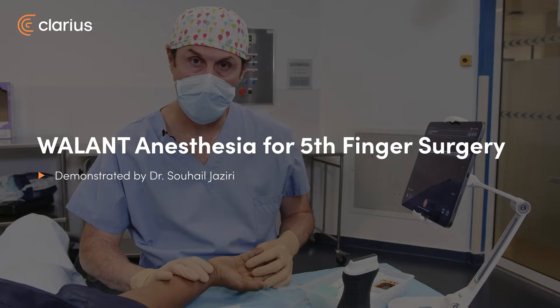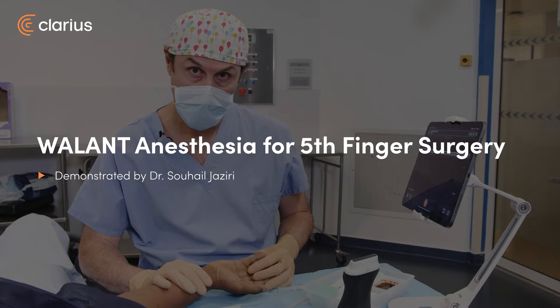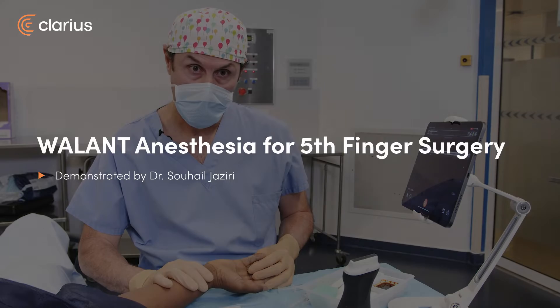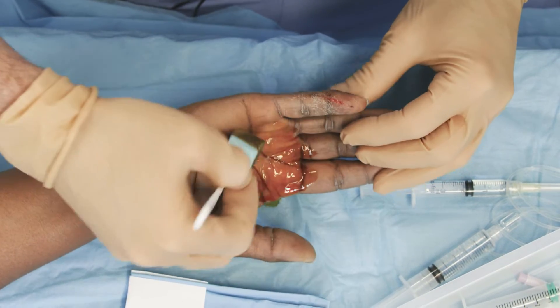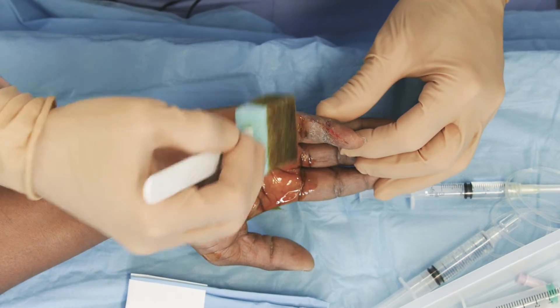Hi, I'm Dr. Jaziri. We are experiencing today anesthesia of the fifth finger of the right hand on an open wound. So we'll do palmar anesthesia in emergency.